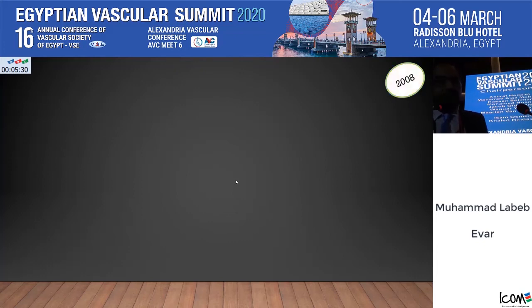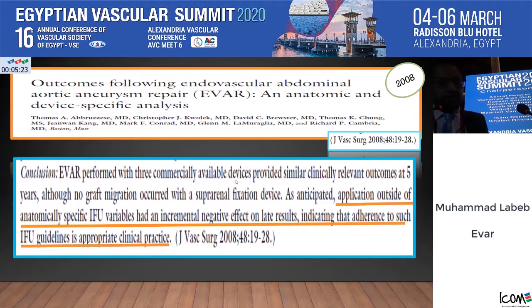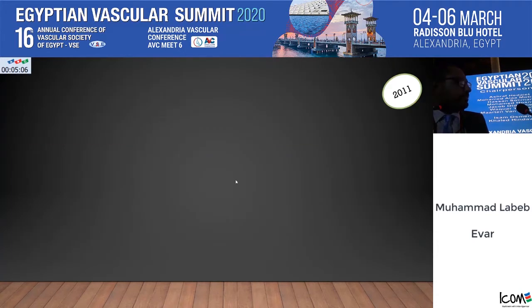In 2008, the first study was published about outside instruction for use, including 560 patients. They concluded that application of EVAR outside instruction for use has a negative effect on late results, indicating that adherence to such instruction for use guidelines is appropriate in clinical practice.